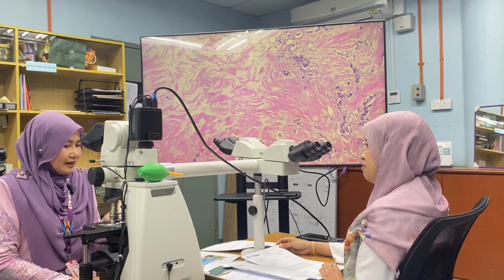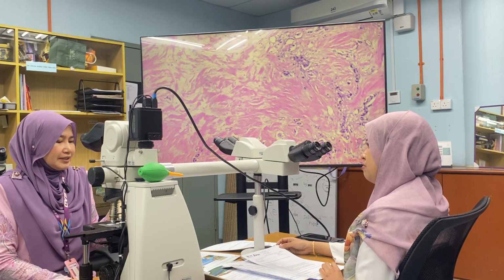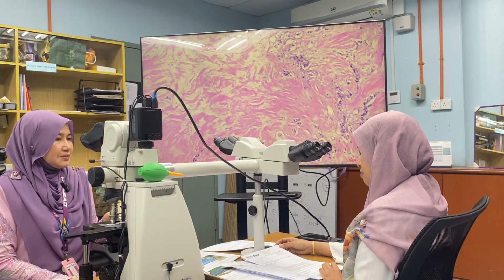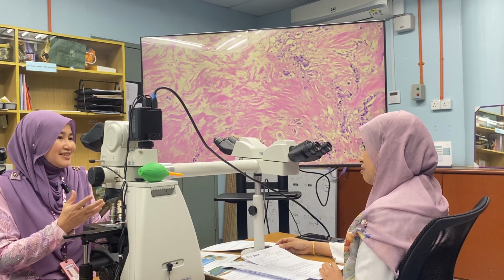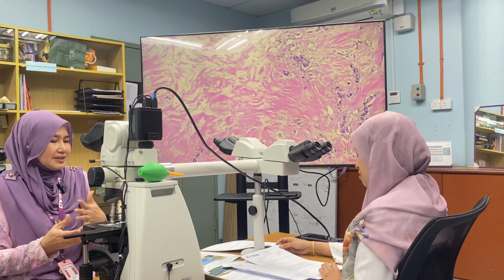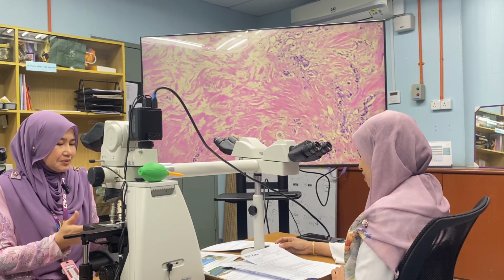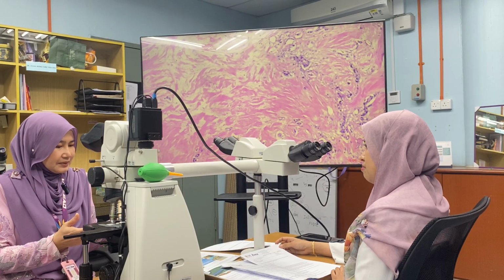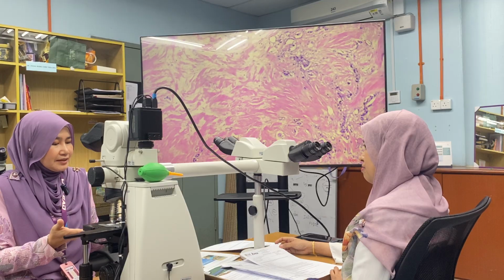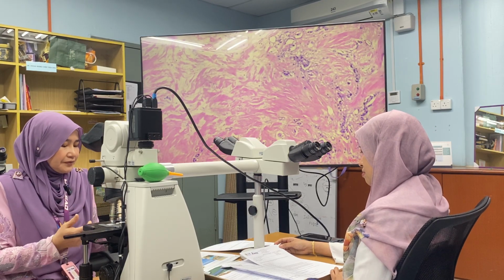And basically you have covered everything, but I found that you were lacking in your description. You did not describe the pathological assessment of the tumor changes post chemotherapy. Not that thorough. And regarding the lymph nodes, the tumor response in the lymph node, for example, and give the percentage for DCIS. And for the HER2, not the percentage, the scoring for the HER2.